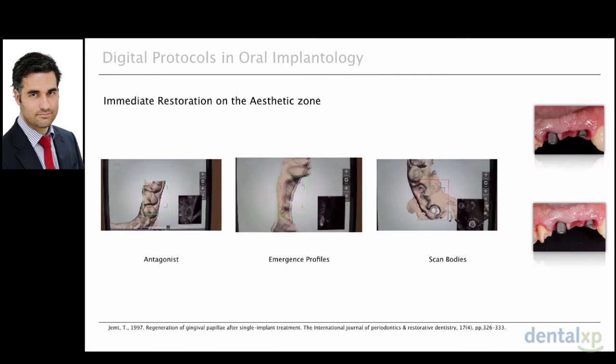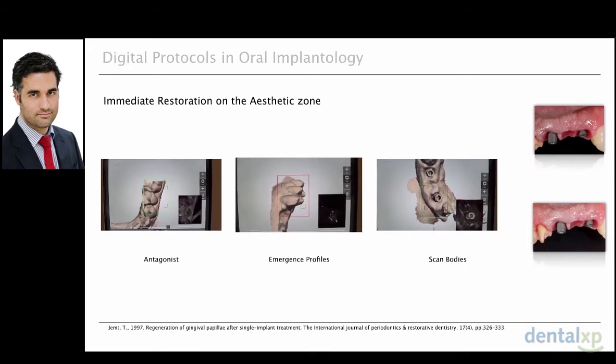These scan bodies are the part of the impression that will tell the lab where the implants are and what kind of implants they are.